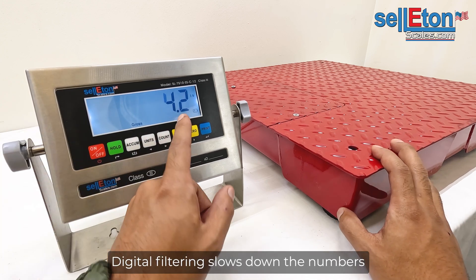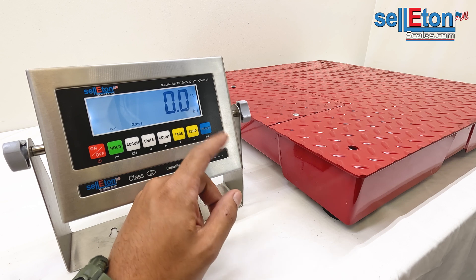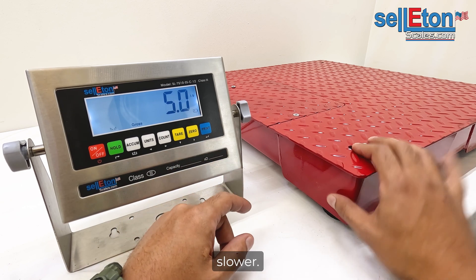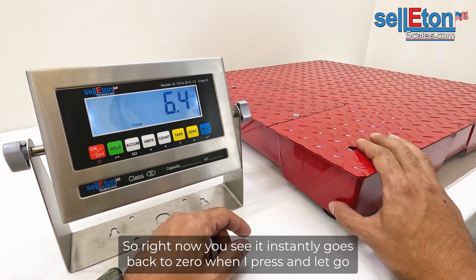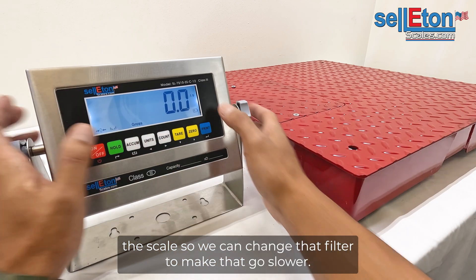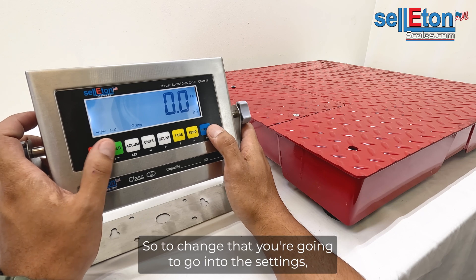Digital filtering slows down the numbers, allowing you to see them go up and go down slower. Right now you can see it instantly goes back to zero when I press and let go of the scale. We can change that filter to make it go slower.